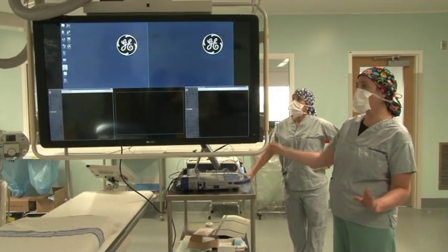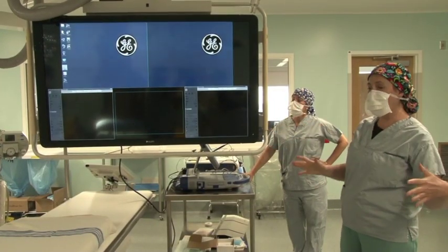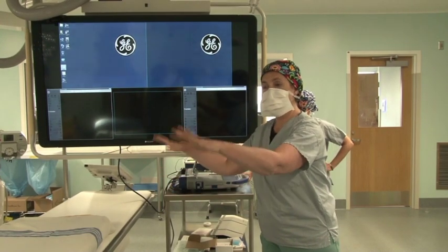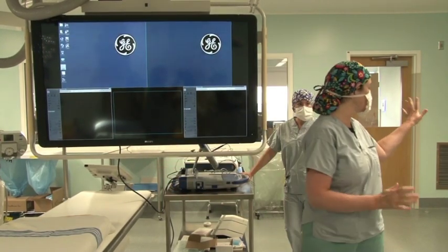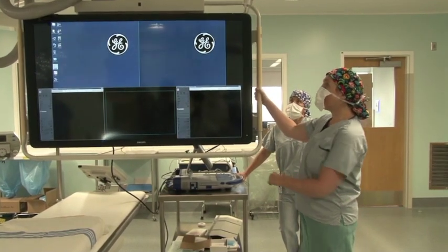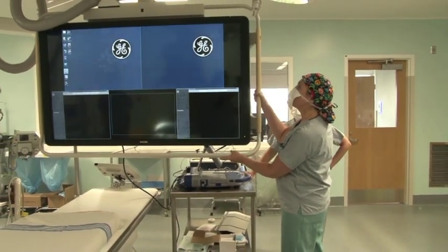And so it does move. We have it set up now so that we have space to bring the stretcher in. So once the patient is in, hooked up to the monitors, we'll take the stretcher back outside, and then this is on a track, and it very easily moves from side to side.